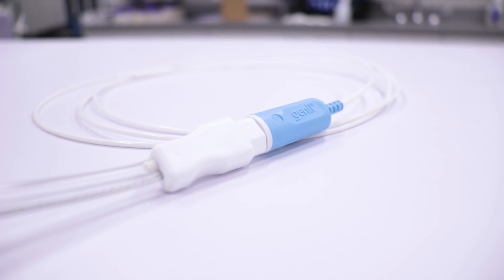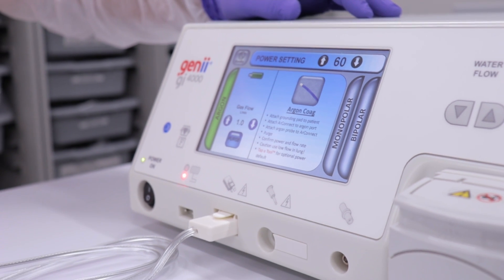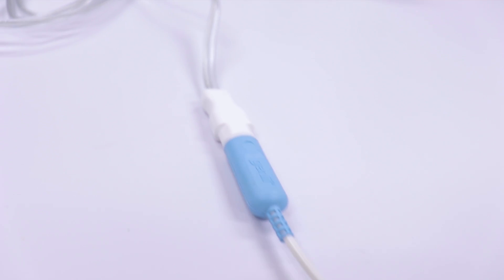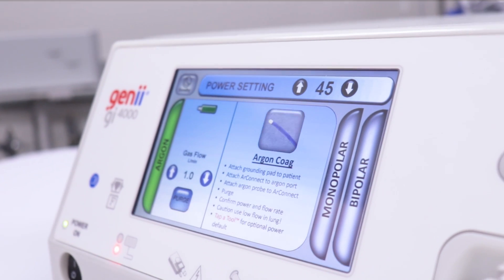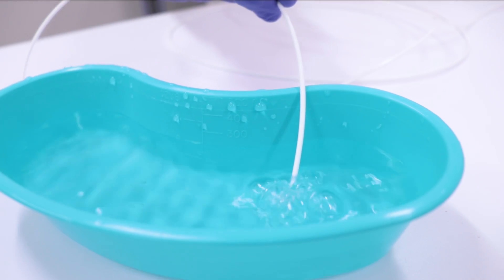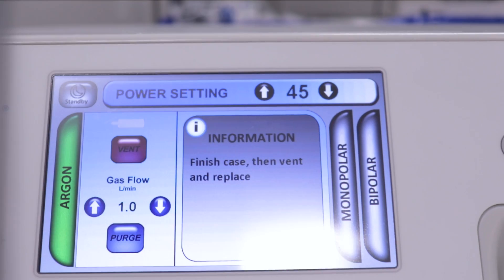Exit standby mode by pressing the touch screen display on the GI-4000. Prior to inserting the argon coagulation probe into the endoscope accessory channel, prime the argon probe by pressing purge on the touch screen display of the GI-4000. Once the argon system has been primed, the GI-4000 will continue to purge the argon every 30 seconds until the system is power cycled.